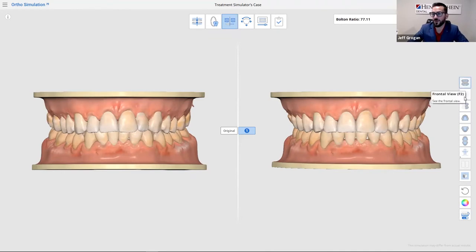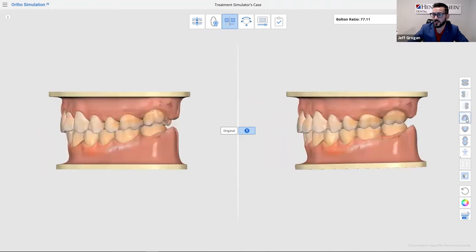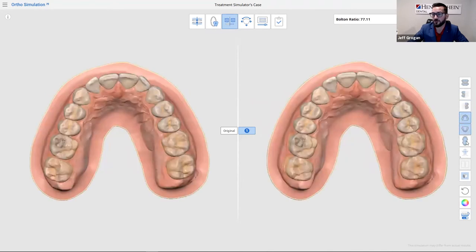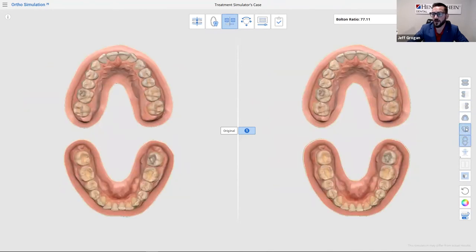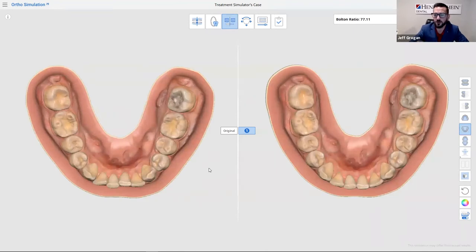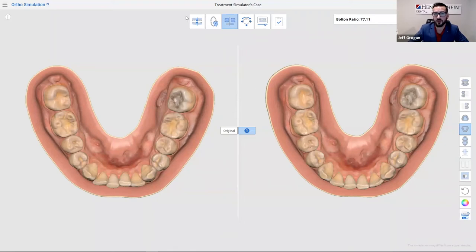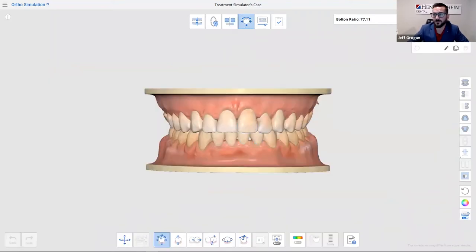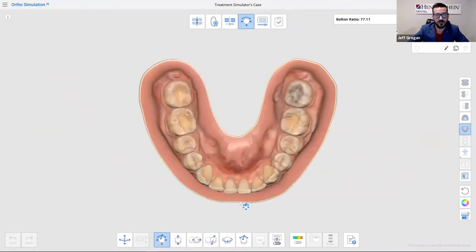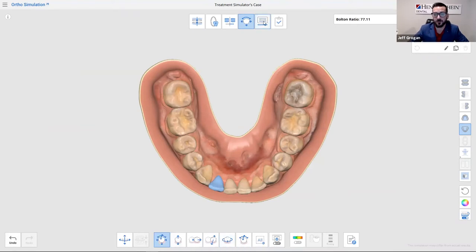I can start to pan this model and look at different views side by side — tops, bottoms, both arches together. Focusing on the lower arch, you can see in this case there was just a touch of relapse crowding, and here is how the simulator put that back into what it would consider proper alignment. I can also go one step further — if I didn't like the initial simulation, I have all of my orthodontic measurements available and can make tweaks on my own.